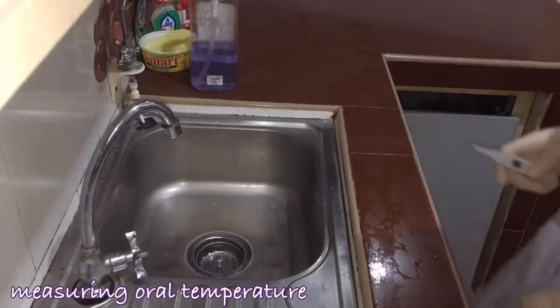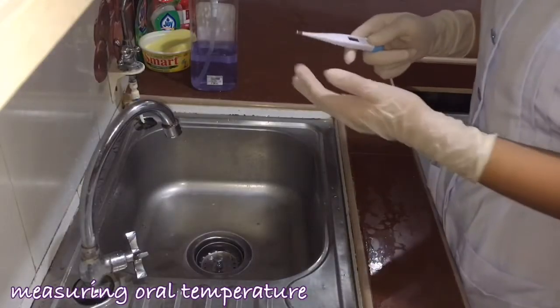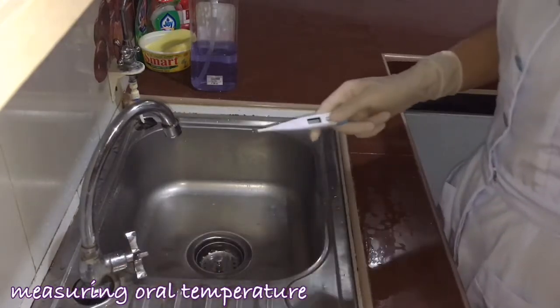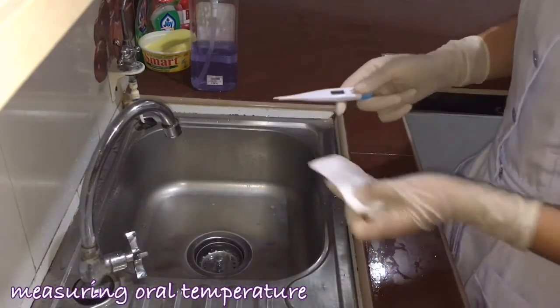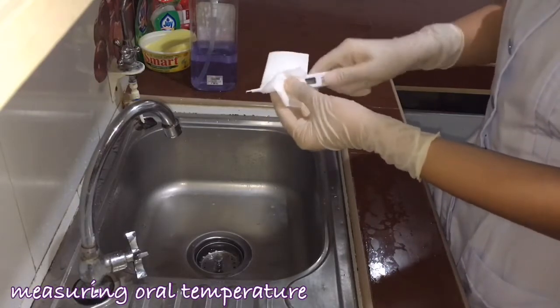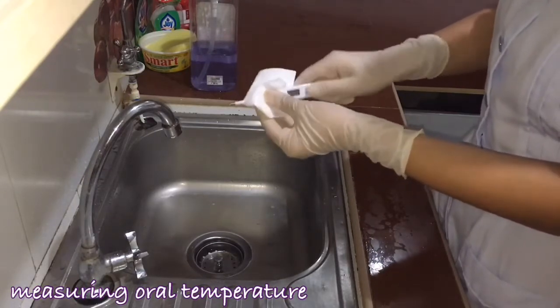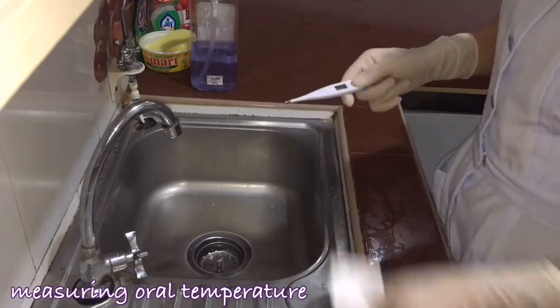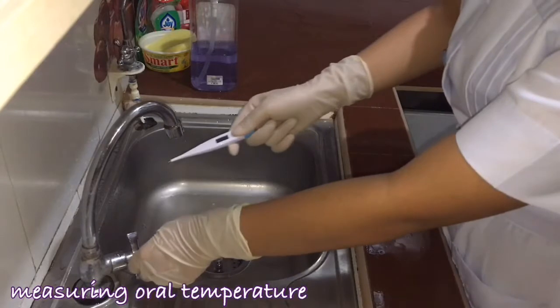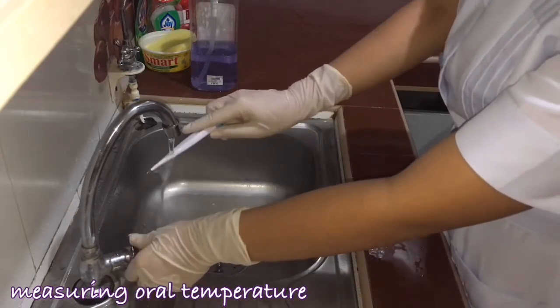Now I will clean the thermometer by placing the tip over running water. Then I will place rubbing alcohol down the thermometer to further cleanse it. After that, I will again put it on running water and remove the excess.